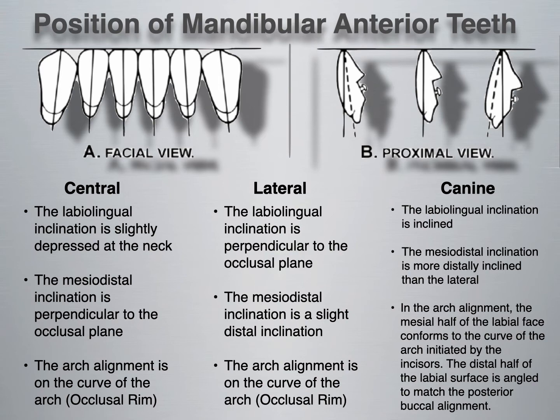Chances are, if you set teeth by maxillary 6 anterior first, and then the maxillary posterior, and then move down to the mandibular posterior, the lower anterior are going to be your last teeth that you set. Usually these fit perfectly within the space provided, as long as the teeth are set correctly in a proper cusp to fossa relationship. Most denture teeth are made to be in a 1-to-1 relationship. That means 1 millimeter of overjet and 1 millimeter of overbite. With that kind of relationship, you should end up with your lower anteriors fitting within that space.